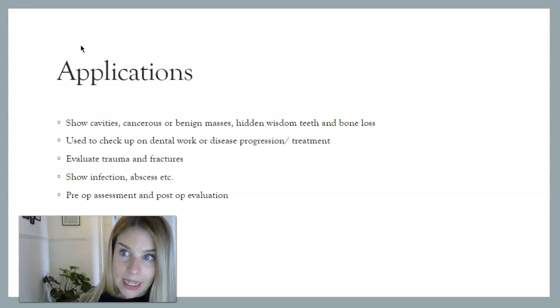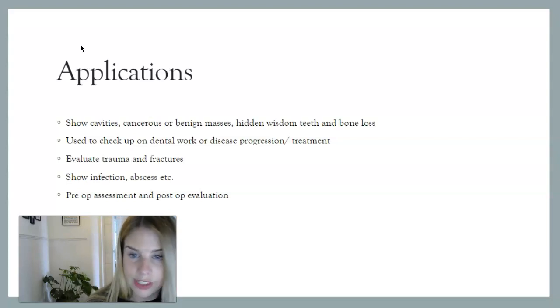One of the reasons that you might see it getting done when you're out on placement and when you qualify, maybe in the middle of the night, you'll get a bleep or whatever it is, and you've got a patient who has had some sort of trauma and they might need images of their mouth. It can also show infection. Obviously, infection can really turn quite serious quite quickly. So if someone has an abscess in their mouth or an infection in their gums or whatever it might be, dental radiography can help show that. And then people who are going in for treatment that's a little bit more serious, so like an actual operation of the jaw or the mouth or the teeth, they can have x-rays pre and post that.